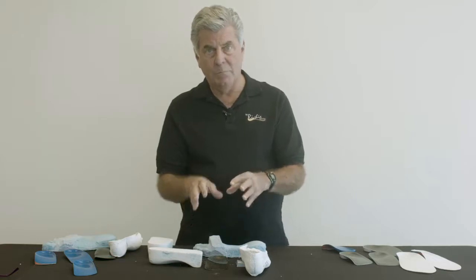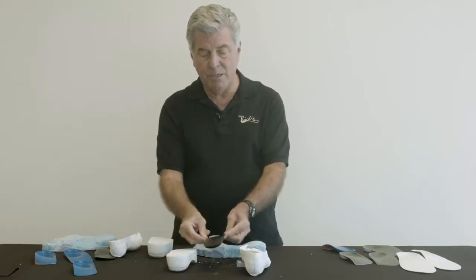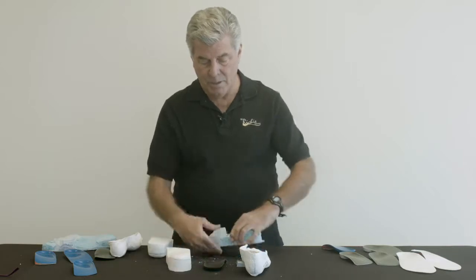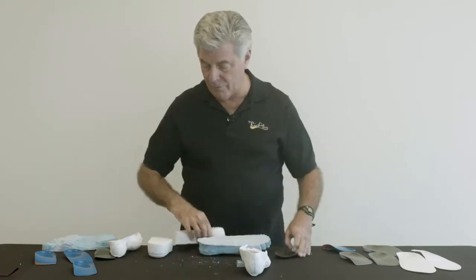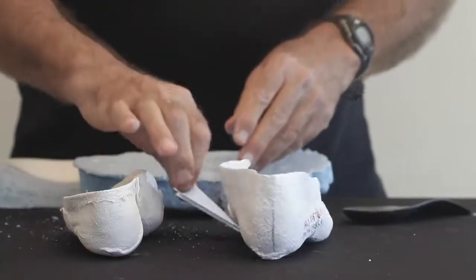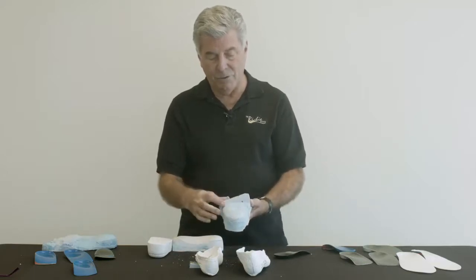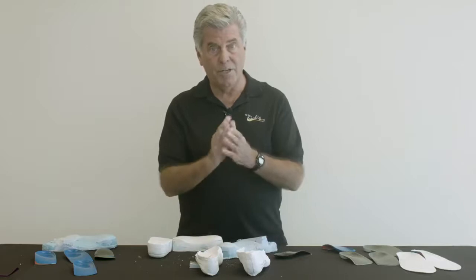Somewhat complicated, but hopefully the end result is we understand that the lab can correct the alignment of the orthosis according to the specifications of the doctor by changing the alignment of the forefoot platform. Not all casts show a forefoot varus deformity. This is a cast with forefoot valgus, and in this case the lab will correct it and pour it so that it's perpendicular, and they'll go through the same process of adding a platform and maintaining that alignment as it was poured originally per the doctor's prescription.